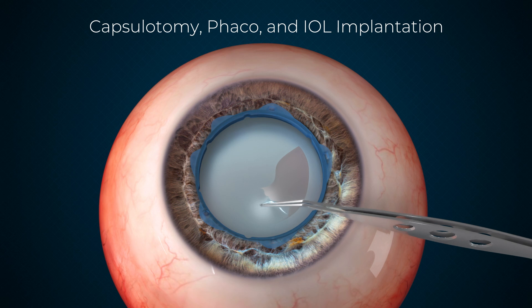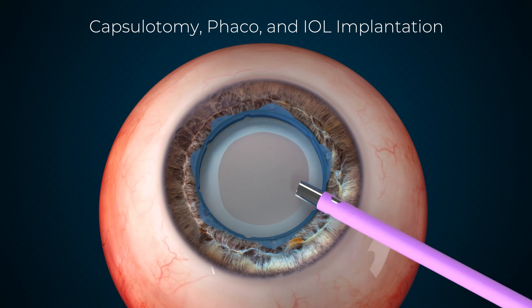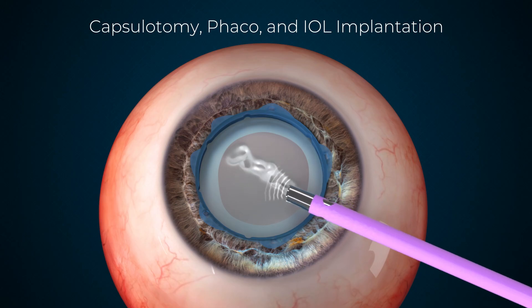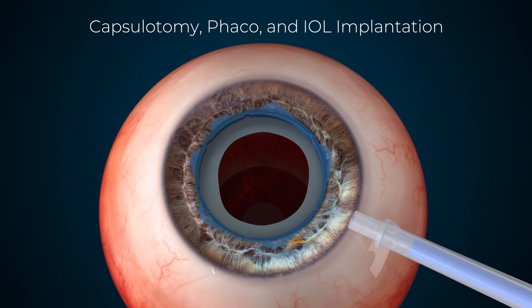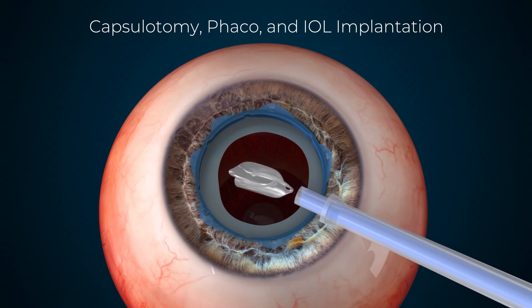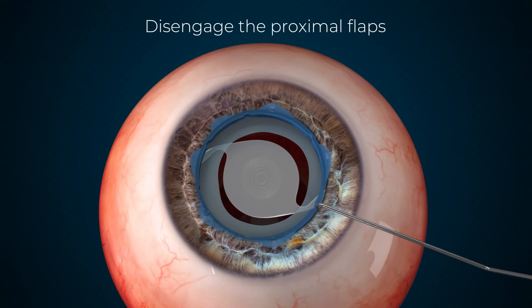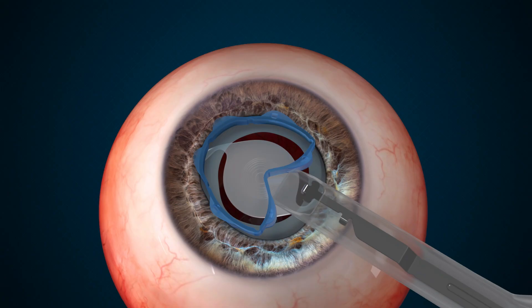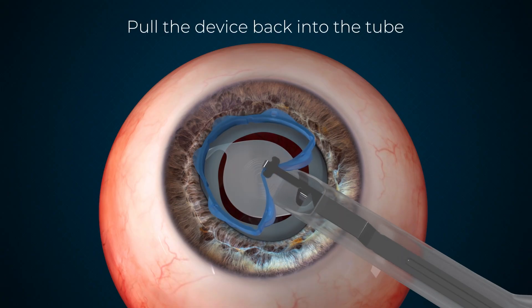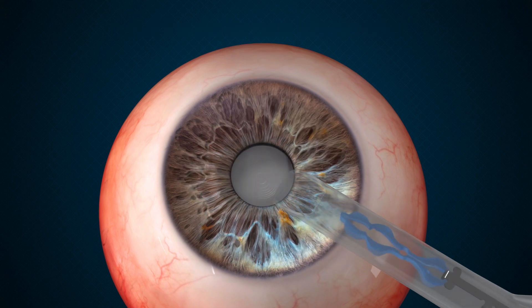Capsulotomy, FACO and IOL implantation can then be carried out. To remove the device, disengage the proximal flaps using the Sinski hook. Reintroduce the injector into the eye using the primary incision. Push the slider forward to extend the metal plunger. Once the metal plunger grabs the device, retract the slider, easily pulling the device back into the tube.